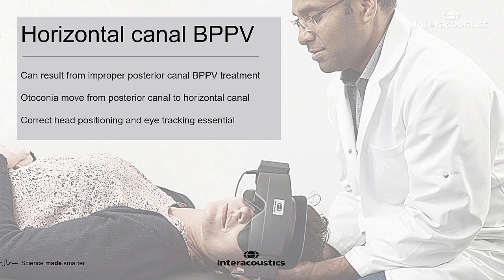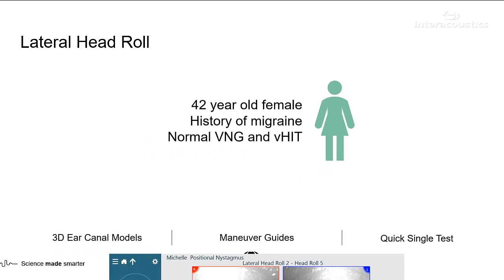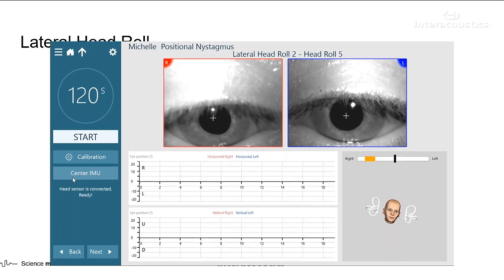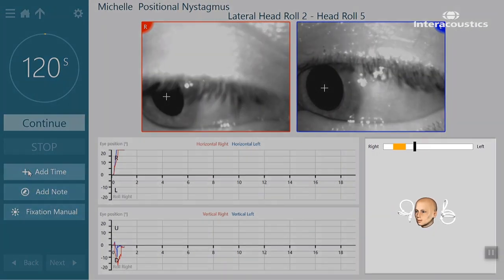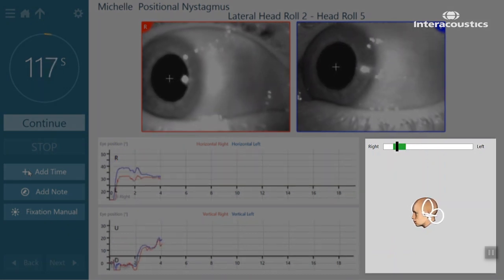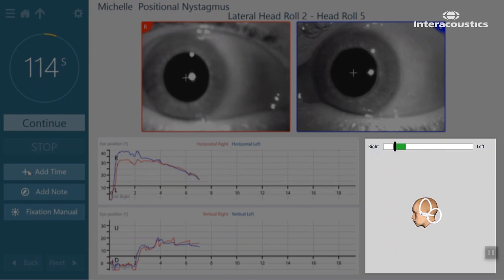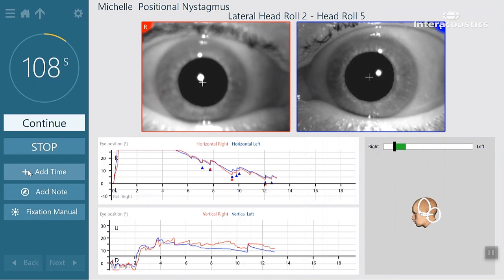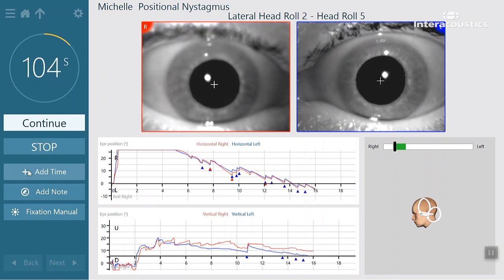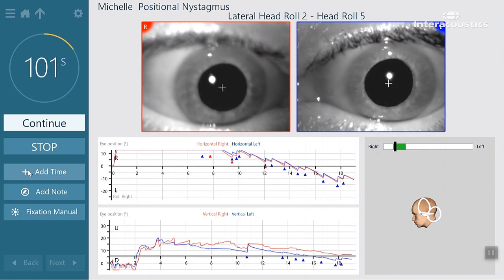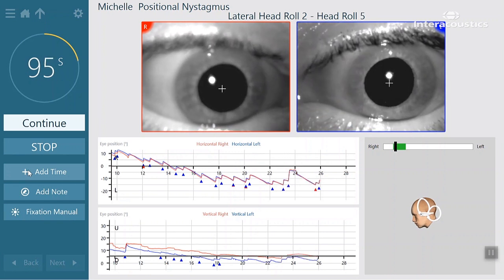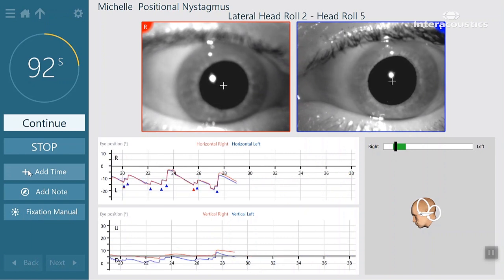Dr. Bonner talked earlier about posterior canal BPPV, so I want to quickly show you a case of horizontal canal BPPV. In this video, the patient turns their head to the right while laying supine — the bar was orange and turns green, indicating we're in the correct direction. As long as the patient has their head turned to the right, we see right-beating horizontal nystagmus. In a moment they'll turn their head to the left, the bar will again go from orange to green, and after a few seconds we'll see the nystagmus change directions.